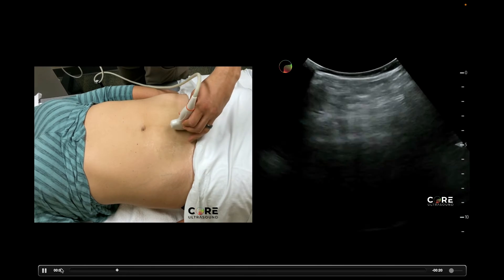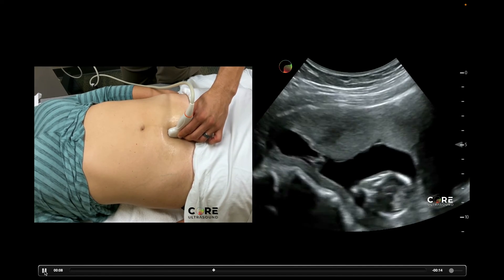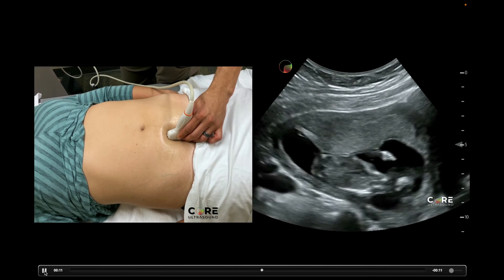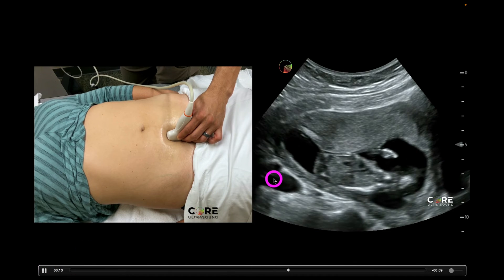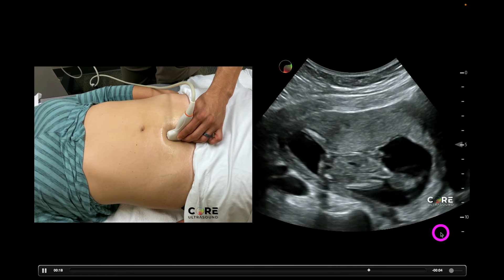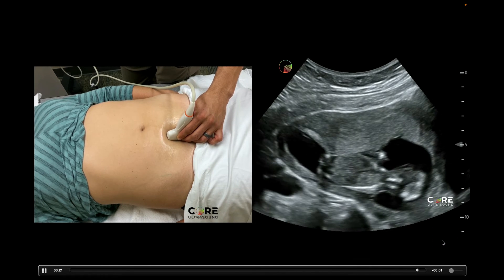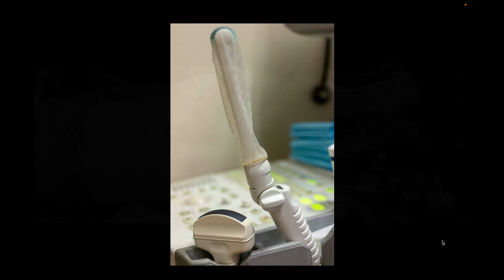That was a non-pregnant patient. This is a pregnant patient and we can see similar structures, but instead of the uterus being empty, we are seeing a full baby inside of that uterus. This is placenta over here. We have some very likely iliac vessels over here, and on this side you can see that pulsation — a nice heartbeat of that fetus. We will discuss in other videos how to identify an intrauterine versus an extra-uterine pregnancy and how to determine the age of the fetus as well as its viability.